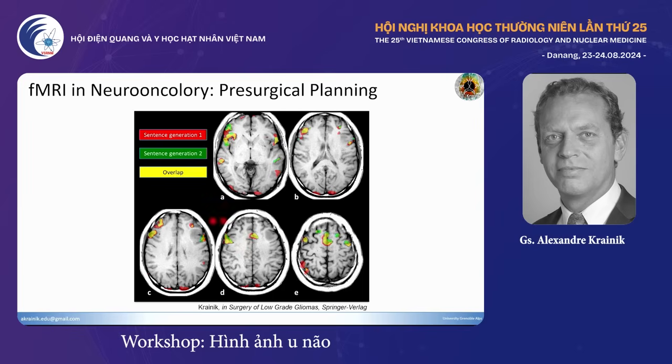and a first time, you see, in red. The idea is the patient is at rest, and after 30 seconds, he hears some words, for instance, glass, and he has 2 seconds to produce in his mind, covertly, he doesn't speak, a sentence with the word glass. I don't know, for instance, this glass is empty.